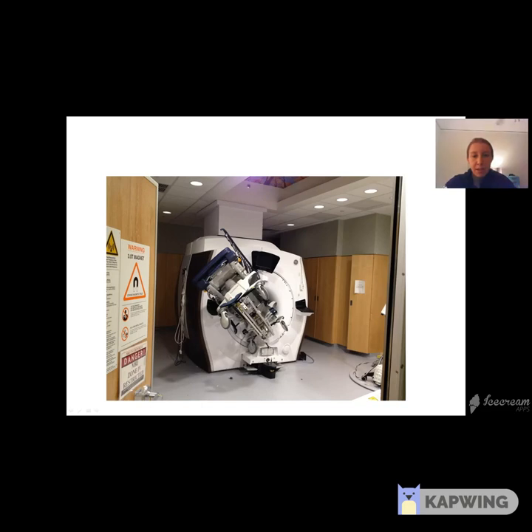And also, this was something that could have been tragic. There was a patient on this before they took the patient off, though, before this actually rammed into the scanner. But obviously there was some ferromagnetic material, and the scanner was pretty strong, was able to pull it in. But if the patient had been on this stretcher, it could have been fatal.